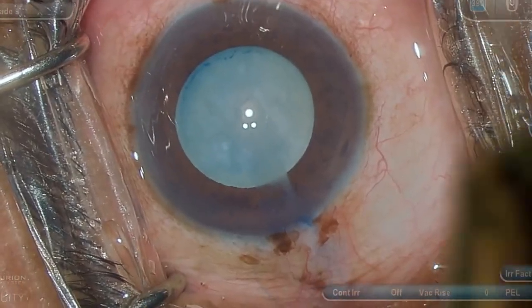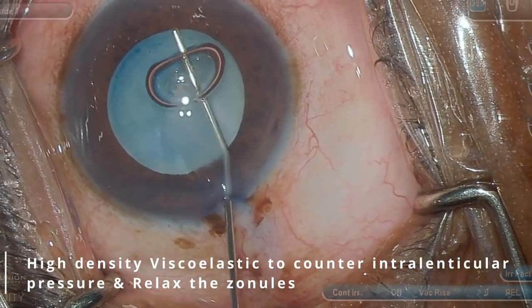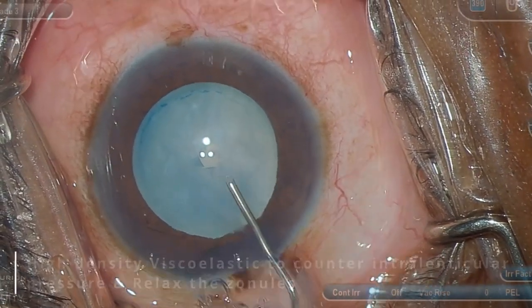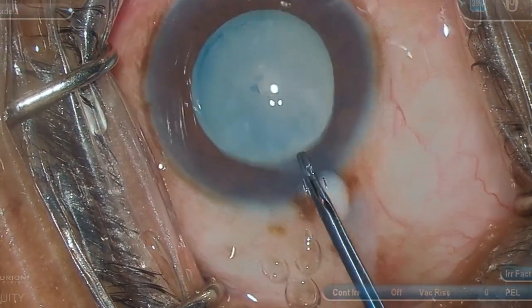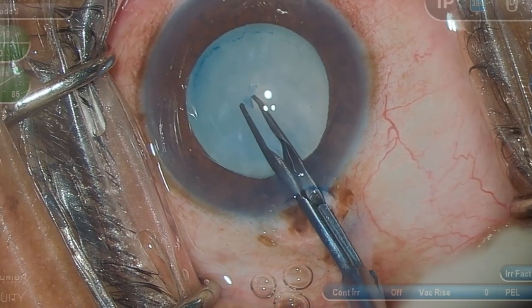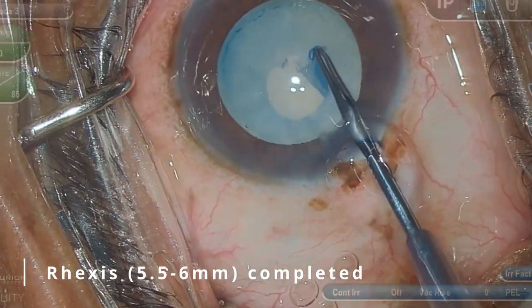Then, the anterior chamber is formed with a high-density viscoelastic such as Viscoat or Discovisc, to counter the intralenticular pressure and to relax the capsular flaps. With the help of rhexis forceps, one of the flaps is held and a rhexis of 5.5 to 6 mm is initiated and completed.